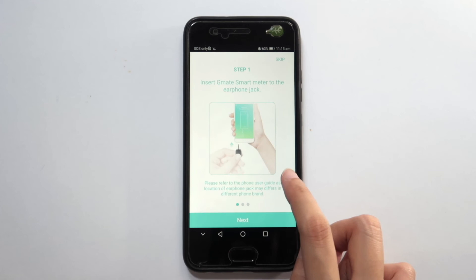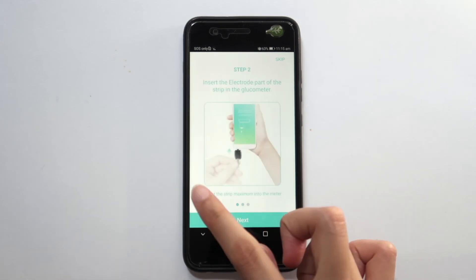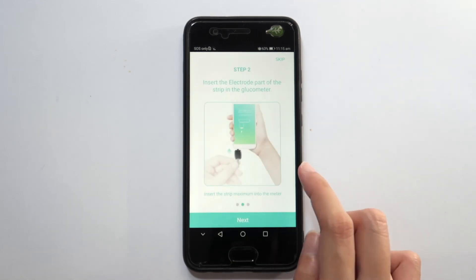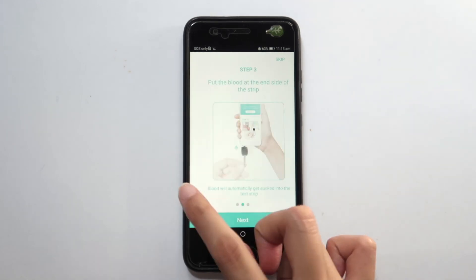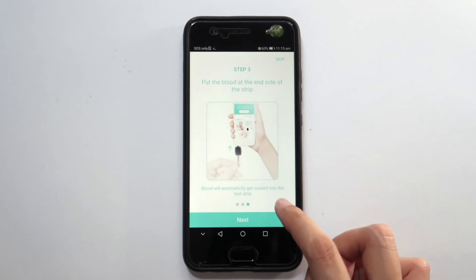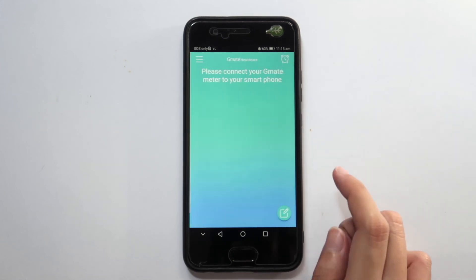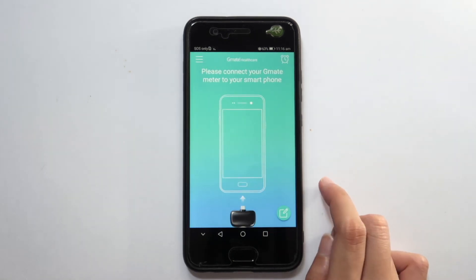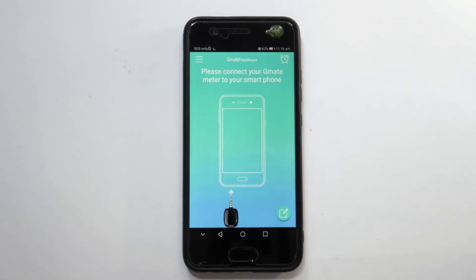A simple instruction on how to use the Gmate glucometer will be shown. Click Next or swipe to complete the guide. And now you have it — you can start your blood glucose test now!